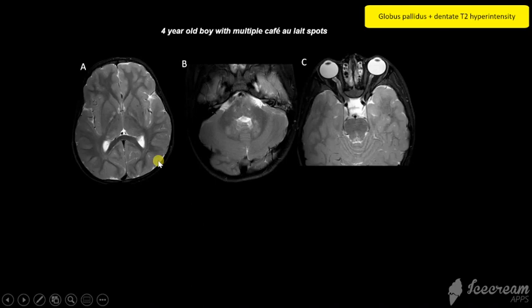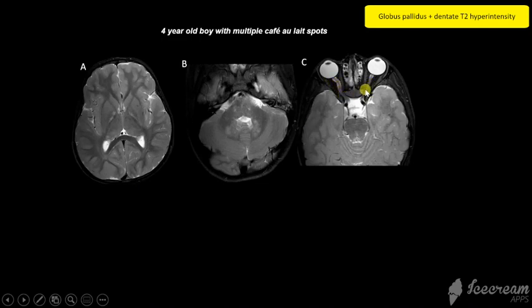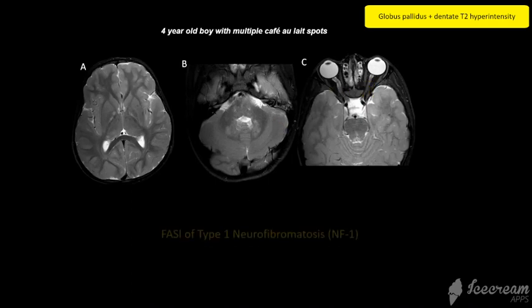This four-year-old boy with café-au-lait spots has bilateral globus pallidus, dentate, and brainstem hyperintensities. The right optic nerve is enlarged relative to the normal left side, so these are the features of type 1 neurofibromatosis.